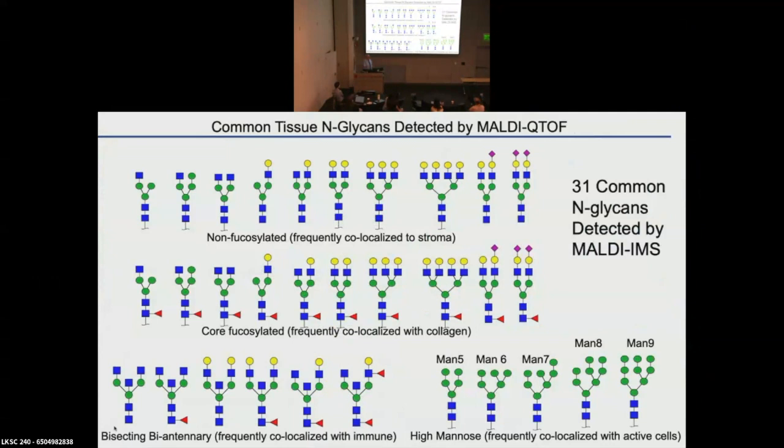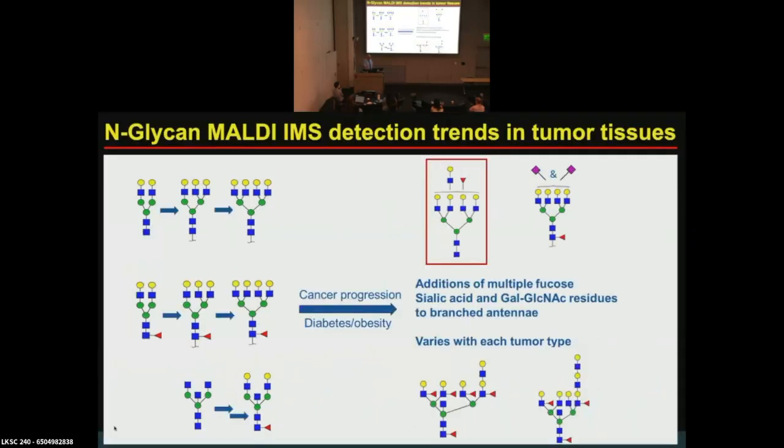And this one, I mean, that's the beauty of it. If you give me any tissue, human FFPE, I'm going to see these. Now, this is, of course, the abundances that will change and the specificities. And so these are very straightforward, but it's again, almost a QC.